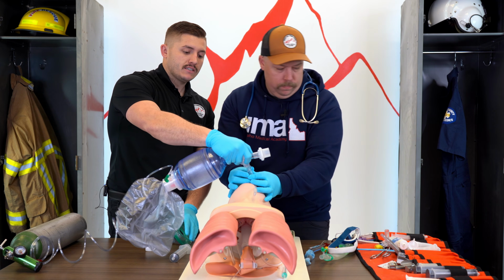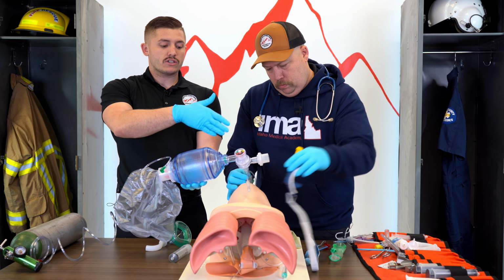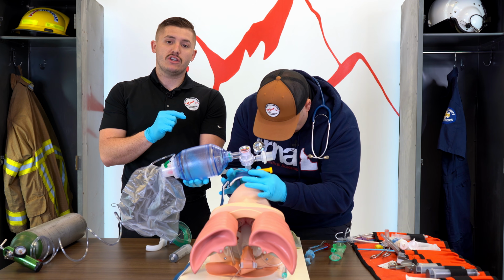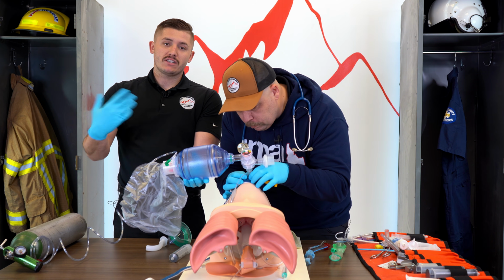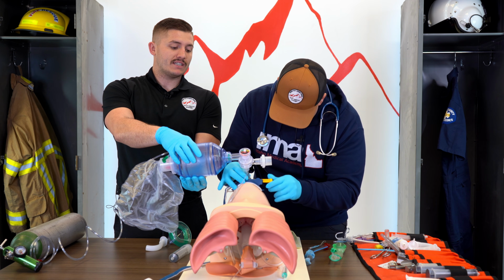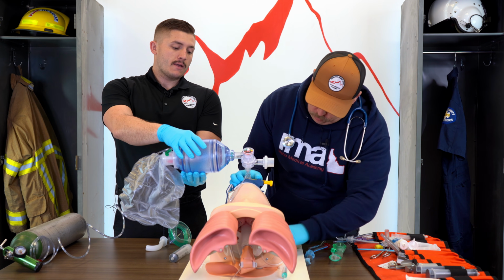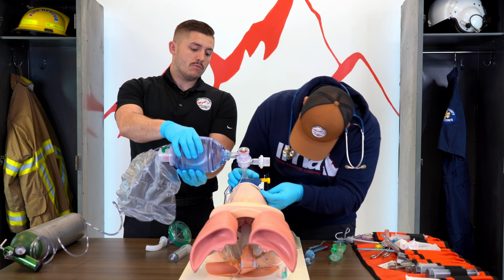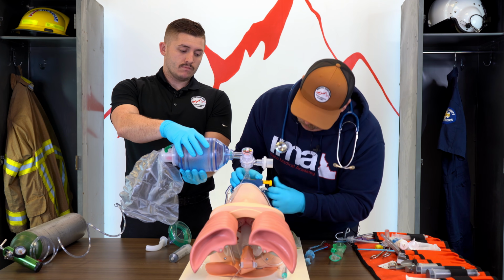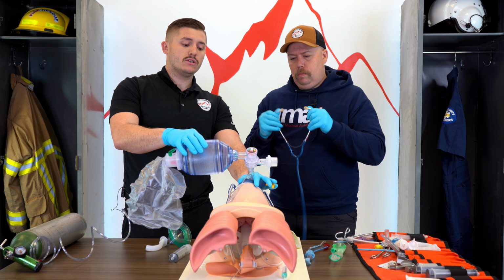Okay, Chris has it placed. I'm going to place my BVM on top, and now I'm going to give a breath. You'll notice Chris is not letting go of that LMA. We don't want to let go of that LMA until it is secured, because once we lose that, we're basically starting from ground zero again. But again, I'm still giving one breath every 5 to 6 seconds. Chris is now making sure this airway isn't going to be moving anymore. As a BLS provider, I'm not the one who inserted it, but I can absolutely be the one ventilating this patient.